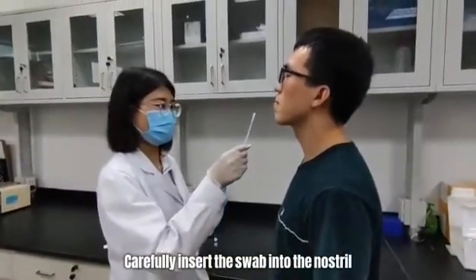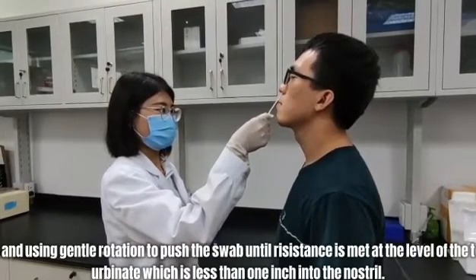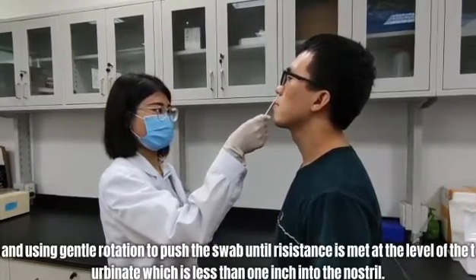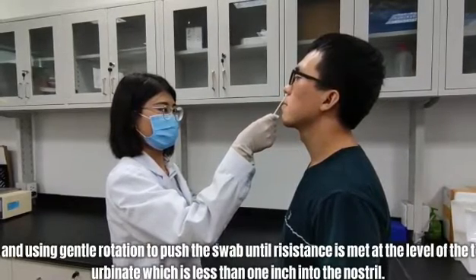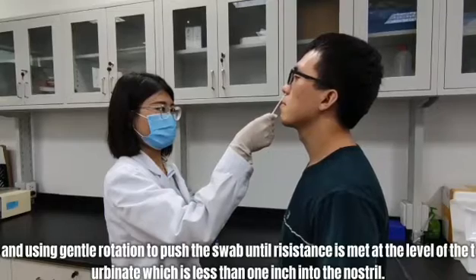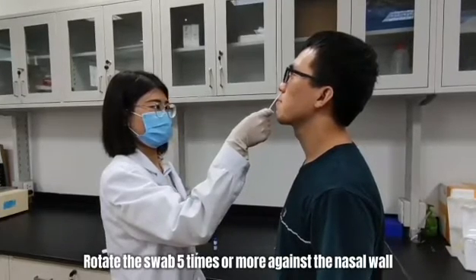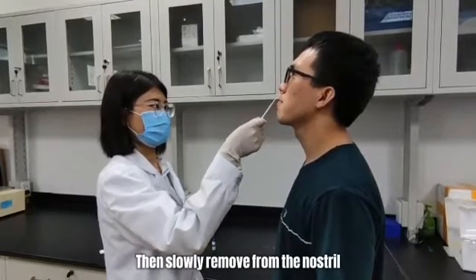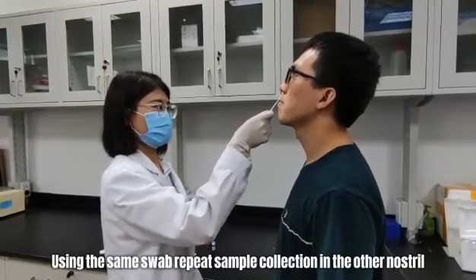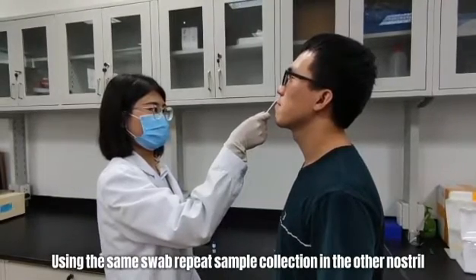Carefully insert the swab into the nostril and, using gentle rotation, push the swab until resistance is met at the level of the turbinate, which is less than 1 inch into the nostril. Rotate the swab 5 times or more against the nostril wall. Then slowly remove it from the nostril. Using the same swab, repeat sample collection in the other nostril.